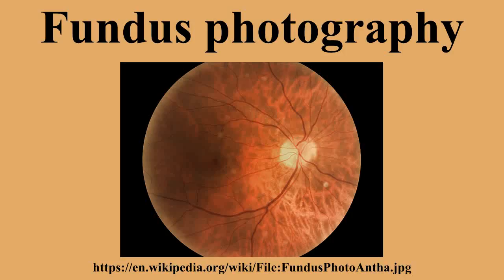For about 75 years a concerted effort was made to clearly photograph the fundus. Hundreds of specialists worked to overcome the problem, which was finally achieved in the early 20th century by Friedrich Dimmer, who published his photographs in 1921. Dimmer's fundus camera, developed about 1904, was a complicated and sophisticated research tool, and it was not until 1926 that Stockholm's Johan Nordenson and the Zeiss Camera Company were able to market a commercial device for use by practitioners, which was the first modern fundus camera.